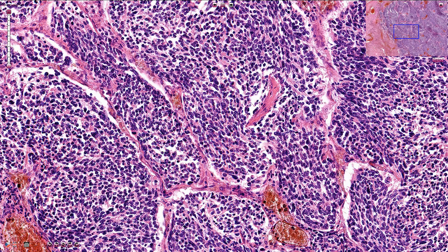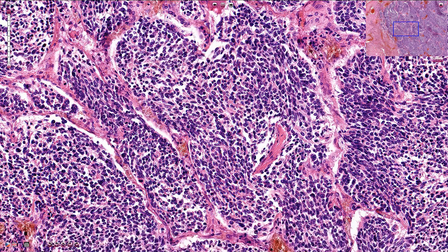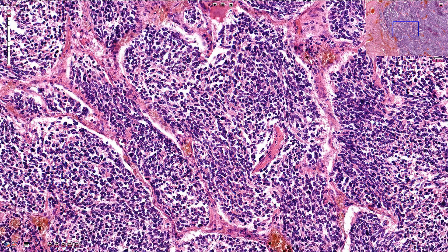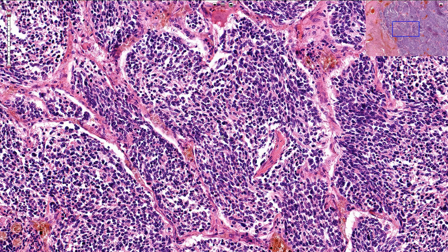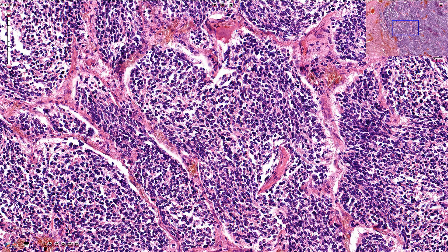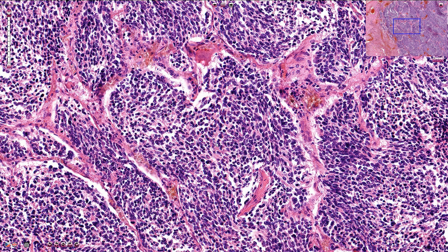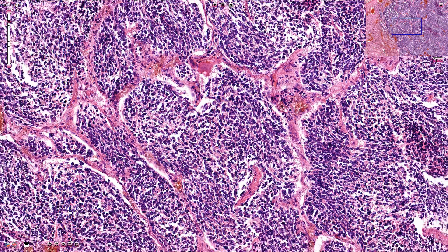This is another mitosis, also here. In this case we can appreciate solid nests composed of cells with minimal cytoplasm and oval shaped nuclei with finely granular chromatin pattern. In between the solid nests we have delicate fibrous stroma with small capillaries or blood vessels.